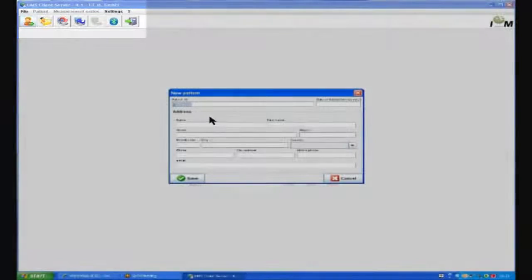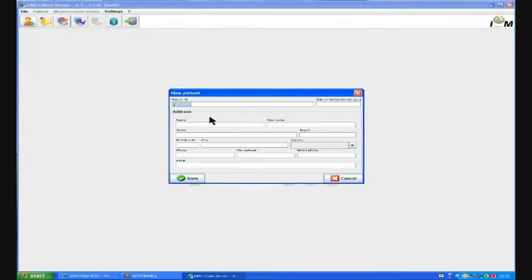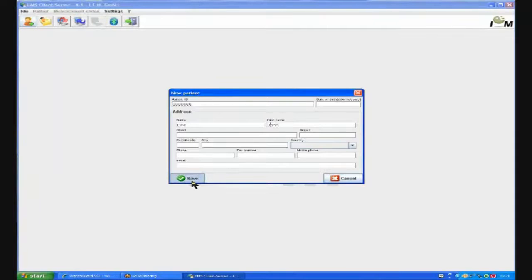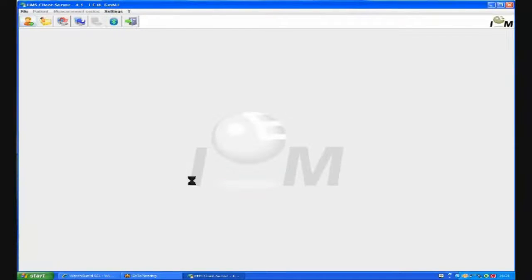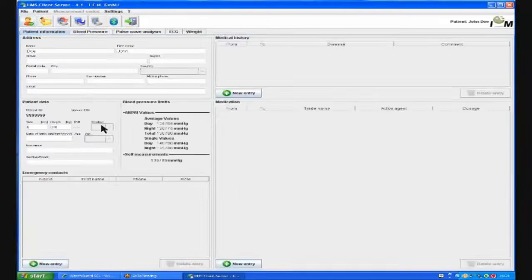If this is for a new patient, we need to press the first icon. We can place a unique identifier such as the NHS number. We can then put in the surname followed by the first name. These are the only mandatory fields. Then press save.